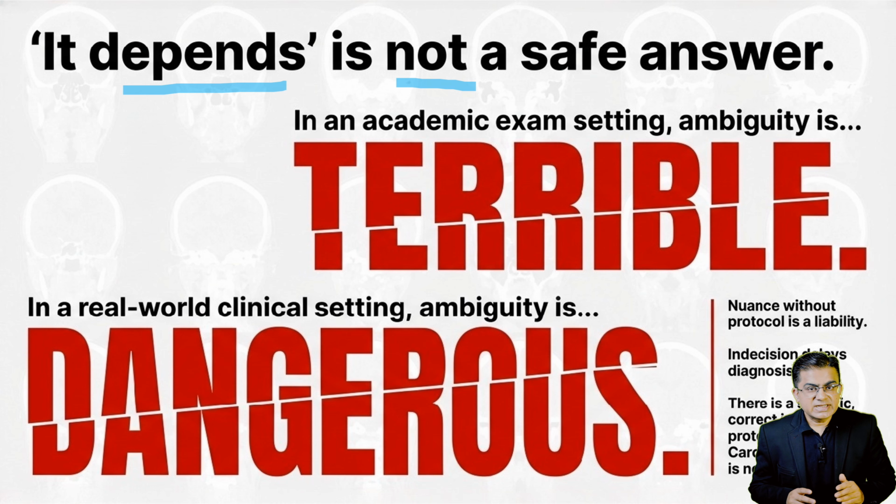You may be one of those residents who order a PET scan for a stage 1 tongue cancer just to be on the safer side, but end up missing the actual depth of invasion of the primary tumor because you didn't order MRI. So today we are going to kill the it depends.